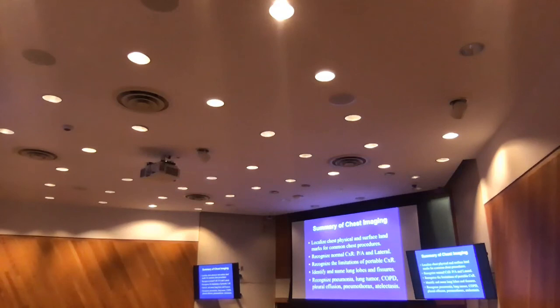Who wants to try that? How would you find atelectasis? Towards the side of the opacification. If it is whole lung atelectasis, we did not show you lobar atelectasis, but that's another advanced topic. We showed you the whole lung. By the way, if you are in front of a very critical mentor, don't call it atelectasis, call it opacified.